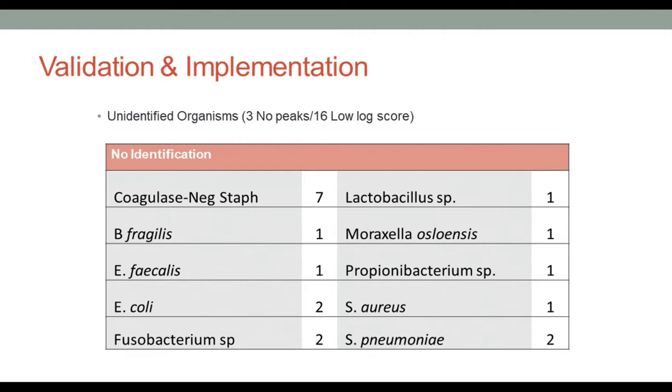It's also made it easier sometimes if you have multiple people that you're trying to train at one point. If you get a new technologist, it takes a little while to train them to do plate reading. And so if you have someone that's training on plate reading and you want to train someone on something different, this is a good bench, and it's fairly easy for a new technologist to come in and learn. They've responded very well to this and have done very well with being able to get these results out in a timely manner.